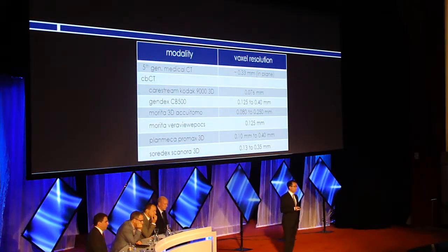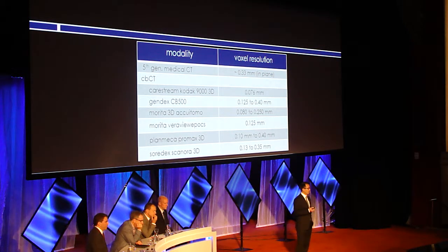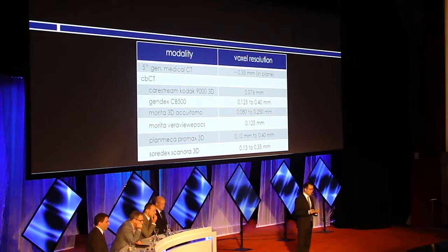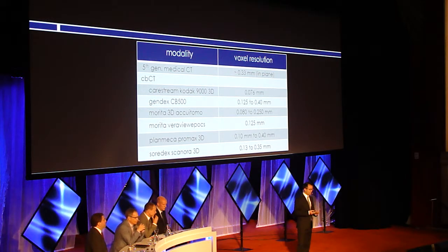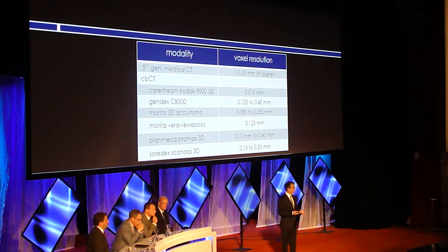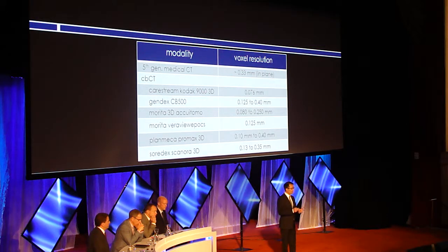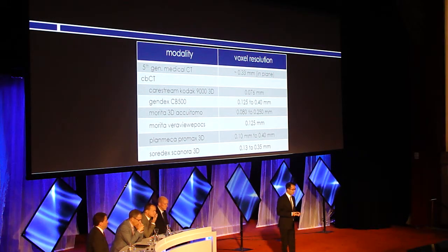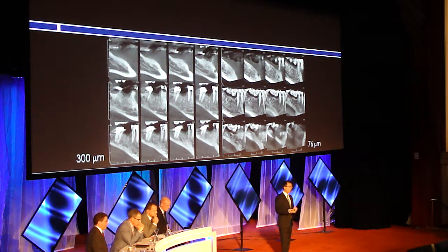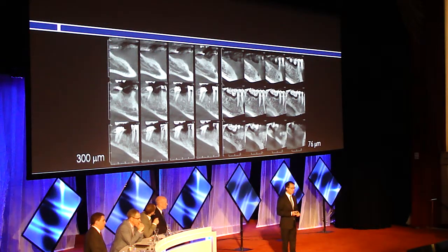Now, one of the really brilliant things about these small field machines is that the voxels that are used to capture the images are exquisitely small. So many of the voxel sizes range from as small as 76 microns to as much as maybe 400 microns. But the majority are clustered around the 100 micron voxel size. The 100 micron voxel size or less produces exquisite images of bone.